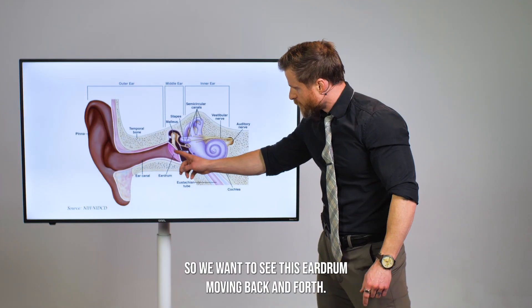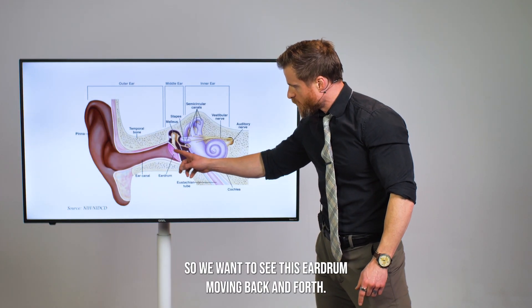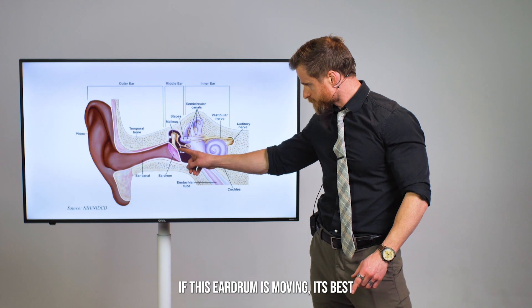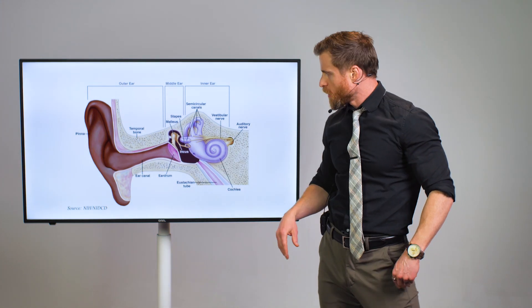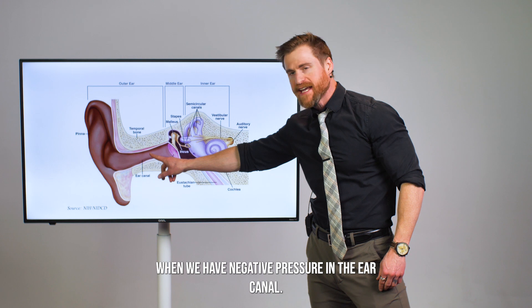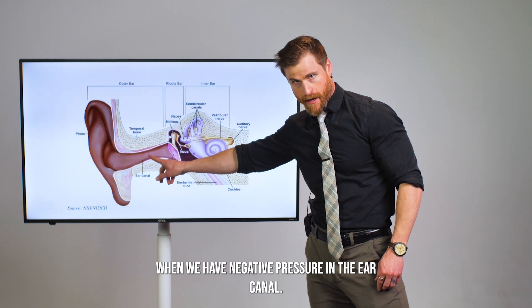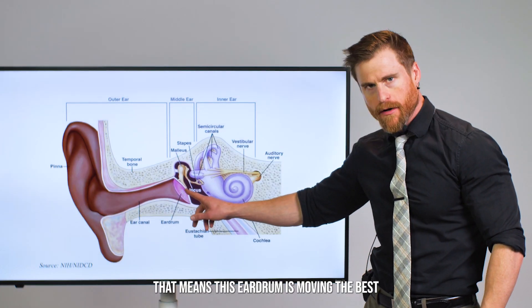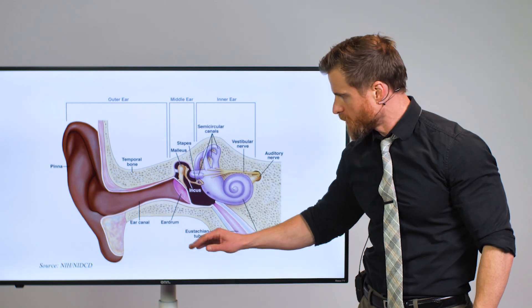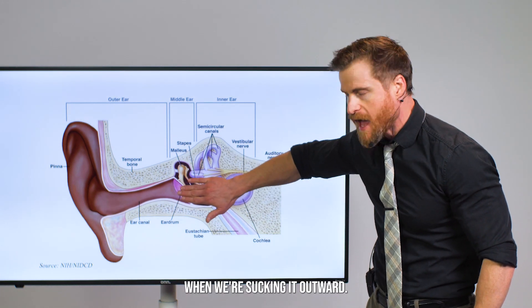We want to see this eardrum moving back and forth. If this eardrum is moving its best when we have negative pressure in the ear canal, that means this eardrum is moving the best when we're sucking it outward. That negative pressure sucks it outward.